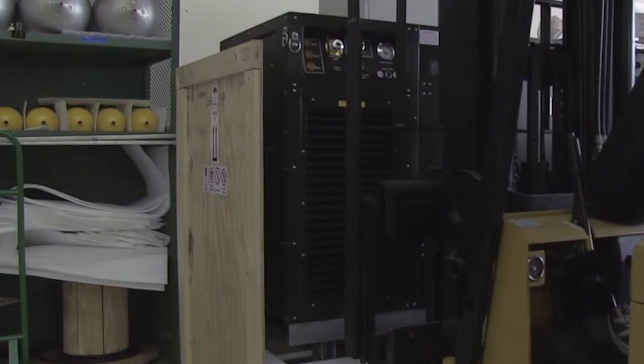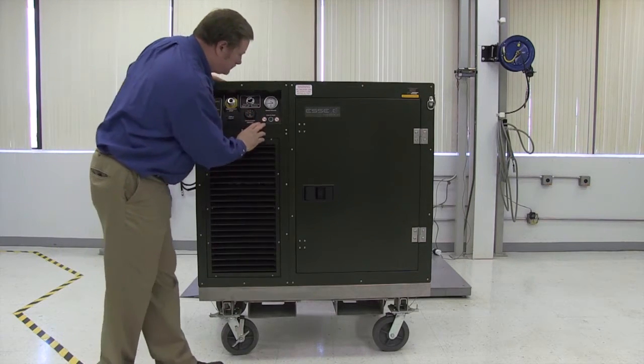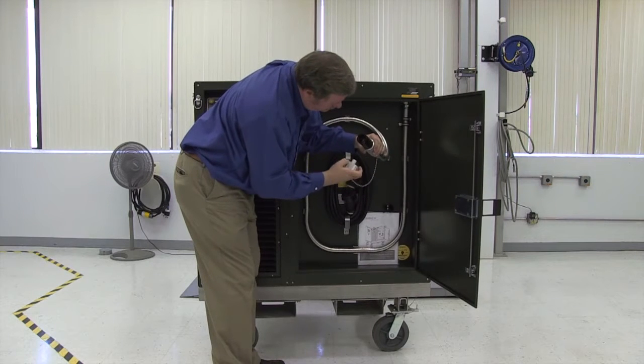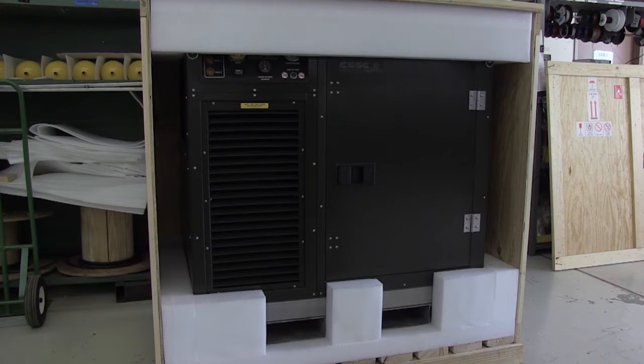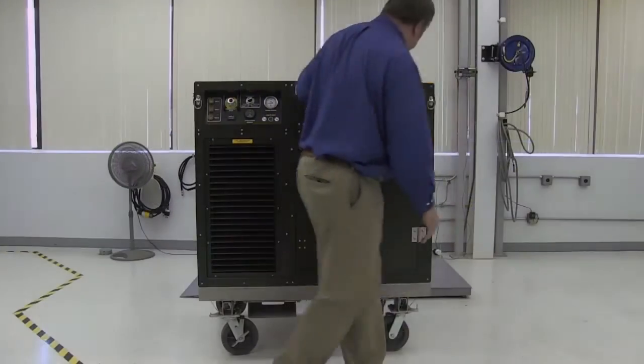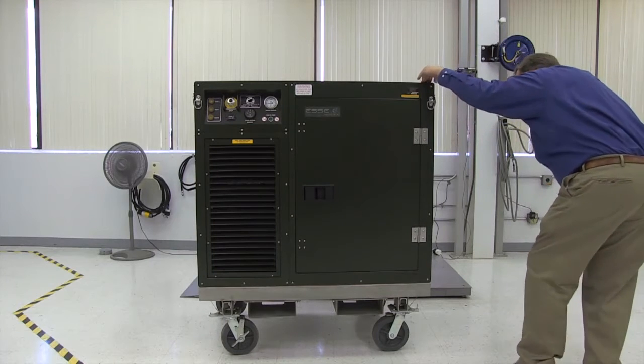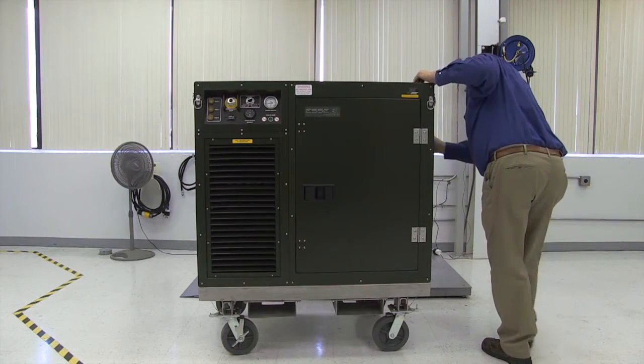Remove the OGL from the shipping container and thoroughly inspect the system for possible damage or contamination that may have occurred during shipment. The wooden shipping crate should be retained for storing or transporting the system. While in service, the OGL should be inspected at least once a month. During the inspection, be sure to check for missing components, severe dents, or any other visible damage.